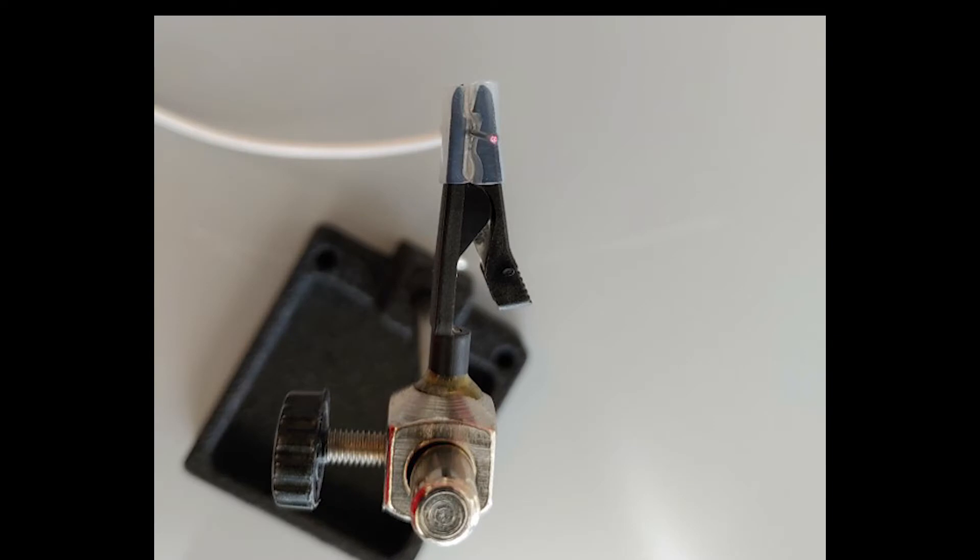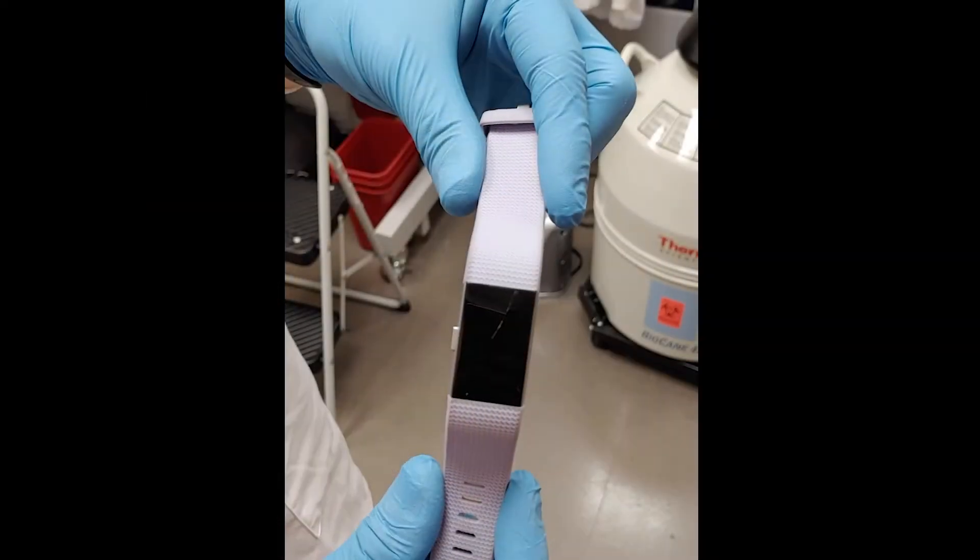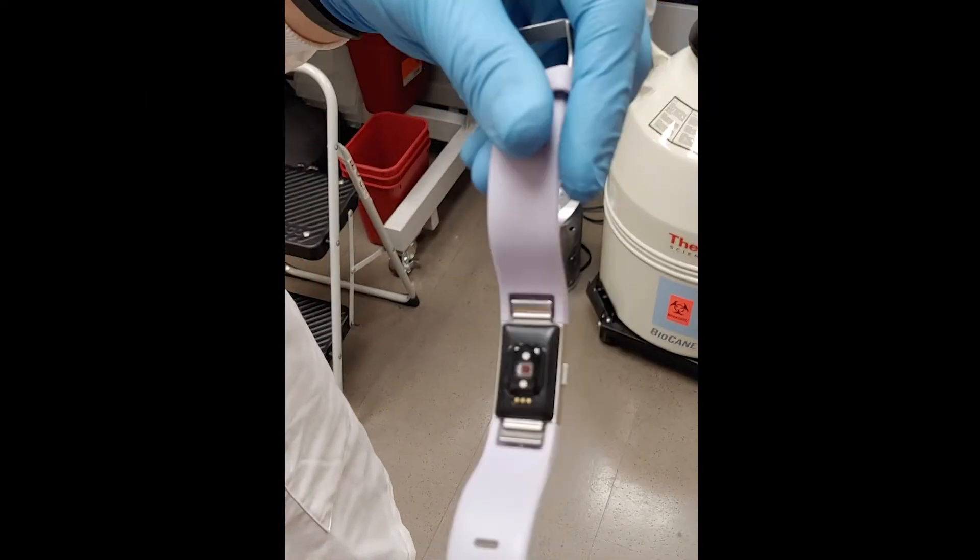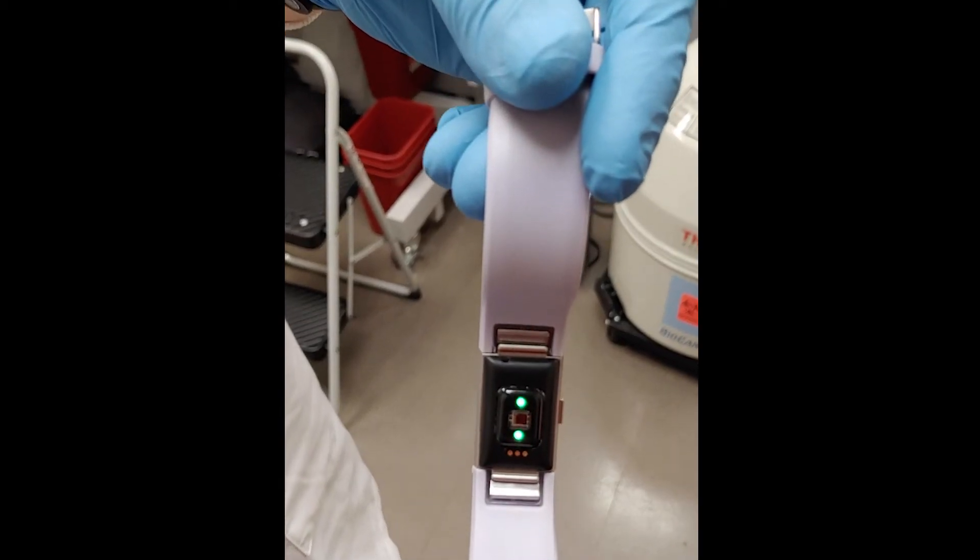The laser is safe and does not cause any damage. In fact, it is very similar to the technology used in fitness trackers and smart watches.